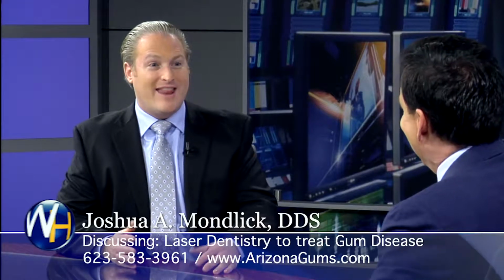I have patients who come in 2, 3, and 4 weeks after the procedure, where you go around their mouth with a laser. They go home. There's no sewing of the gums. We didn't cut anything open, and they go home and they're waiting. Waiting for what? Waiting for pain to settle in, and they never get it.